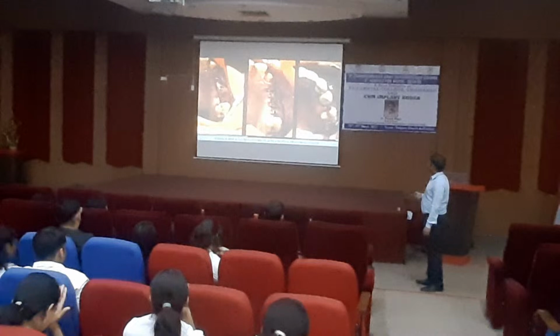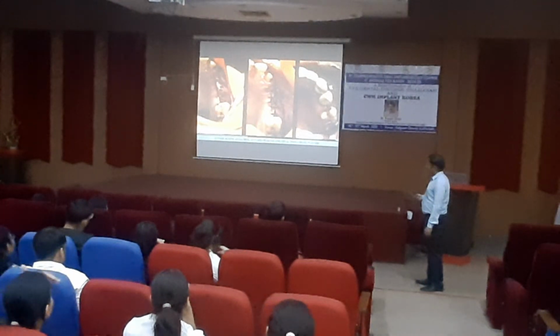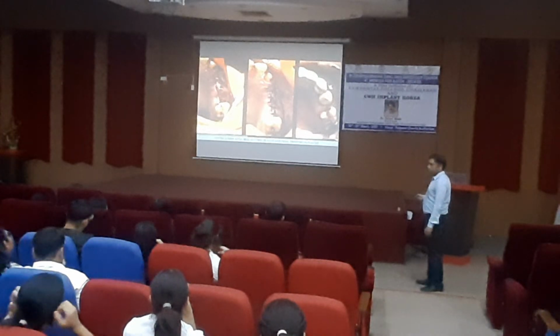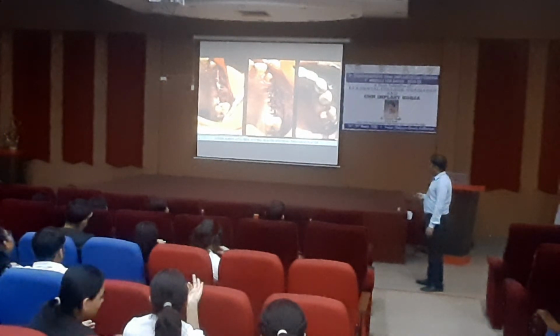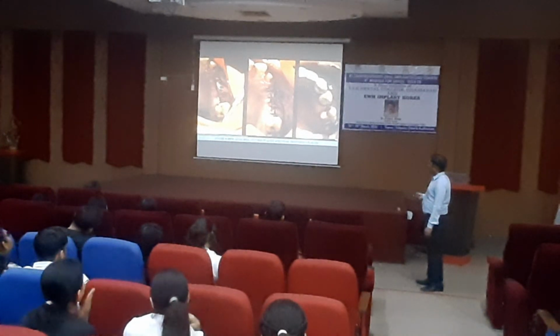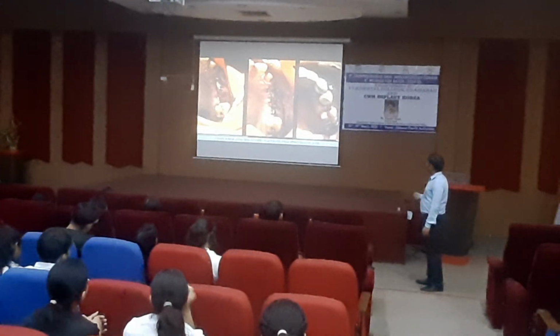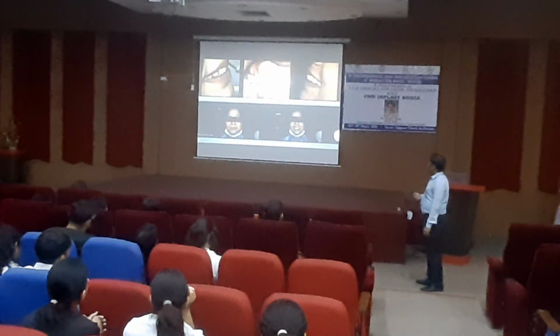This is the implant placement. If you see here, there is very minimal bone around the implant. This area is okay because we have a good amount of bone, but in this concavity near the canine area or the first premolar area, the bone is very less. But with the help of the denser burr, we can expand it. And this is the process.